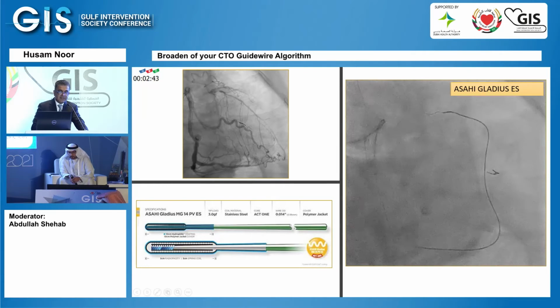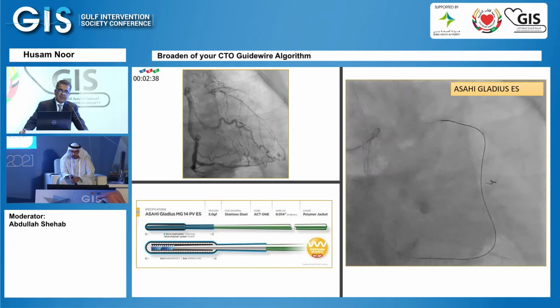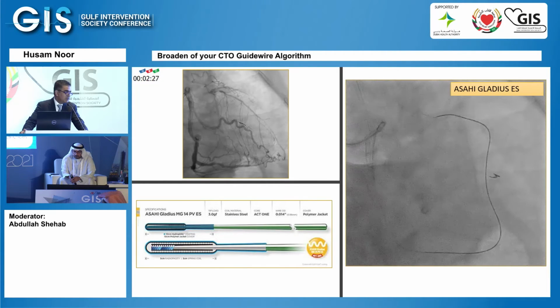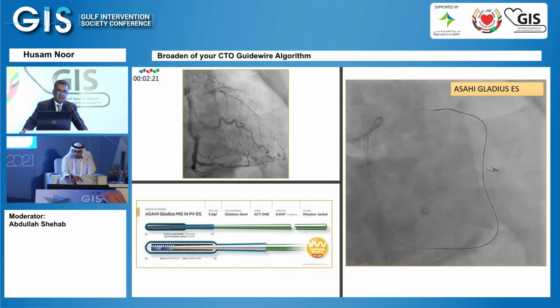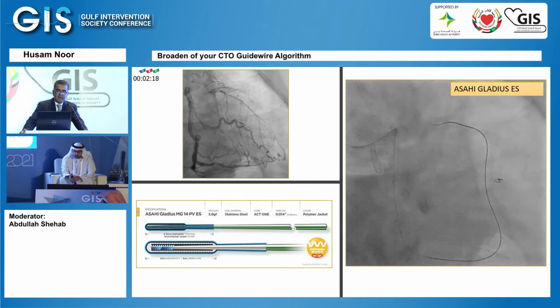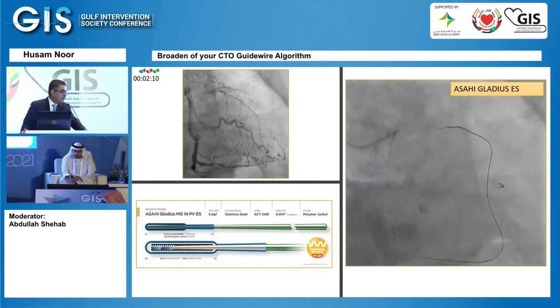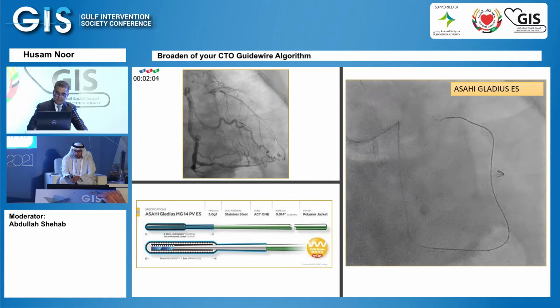Now we reached the distal cap, though we need to connect. As you recall, there was calcium in here, there was tortuosity in here, and typically in these situations, because of the calcium, I didn't use the low tip load Fielder XTR, which was my usual wire. I decided to go with the Gladius, or sometimes I use the Pilot 200, and try to connect retrogradely. As you can see, the Gladius ES wire that I use in this example is stalling, it is not progressing. I'm trying and trying, but I don't spend too much time trying. If it doesn't go, I escalate my retrograde wire strength.